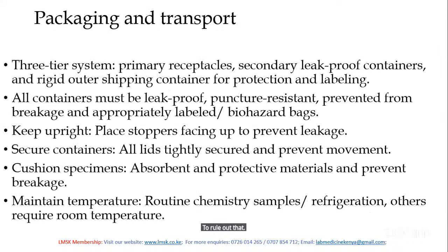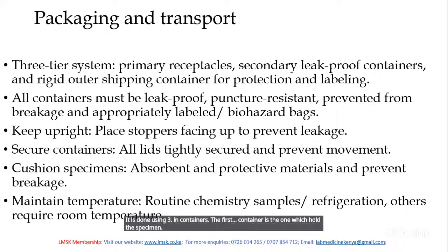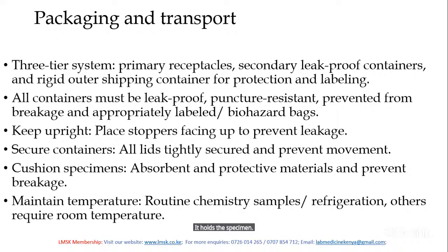Then packaging and transport of what you have collected and properly labeled. Packaging is in a 3-tier system. It is done using 3 containers. The first container is the one which holds the specimen.